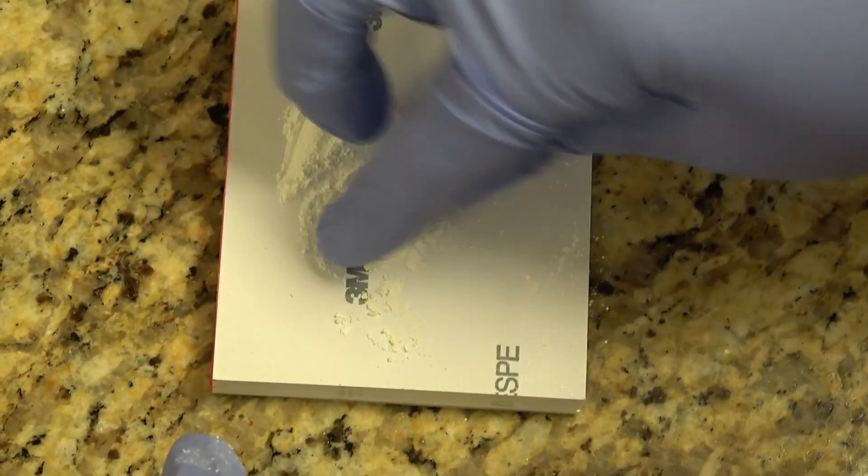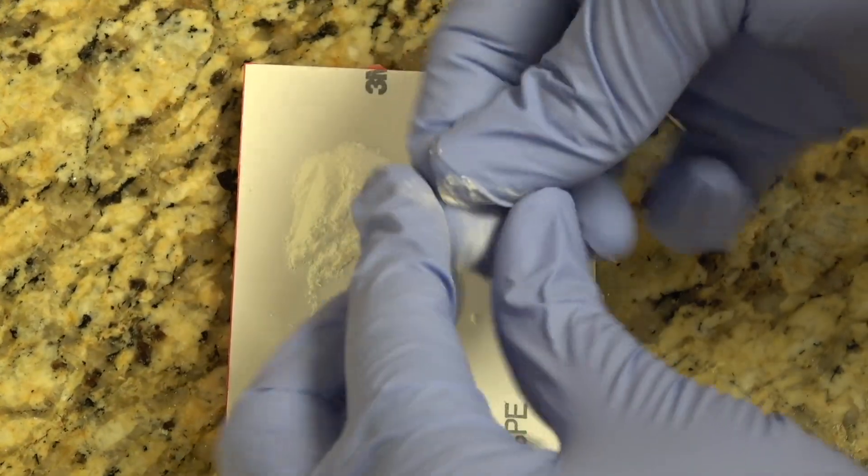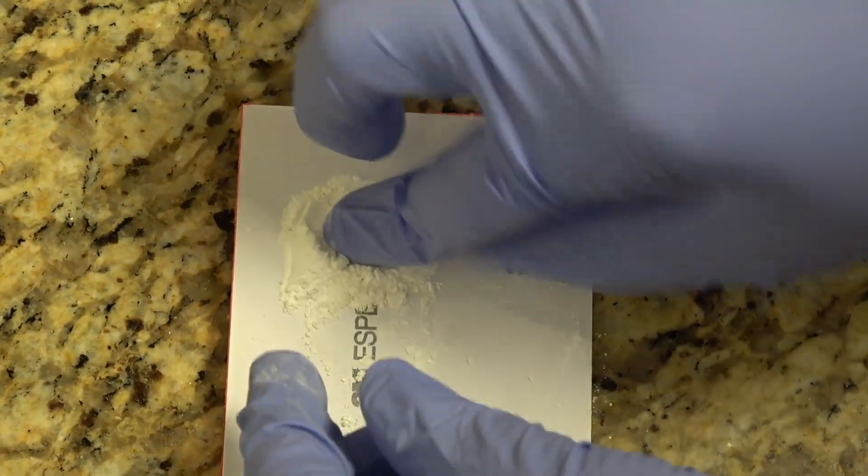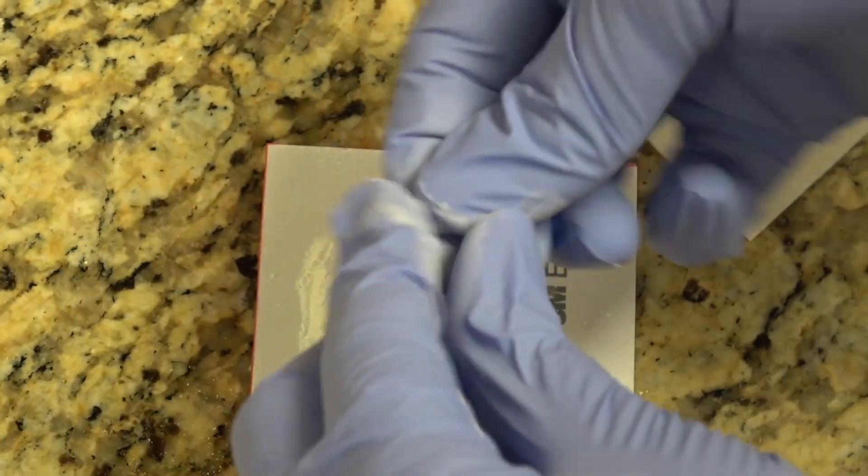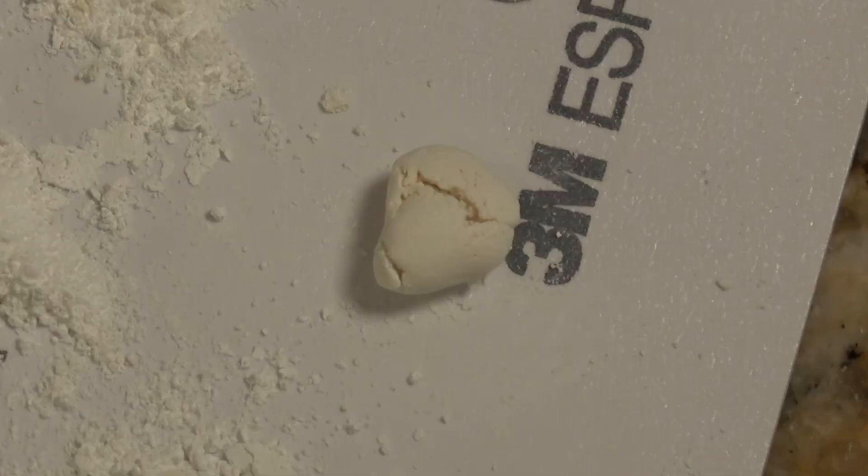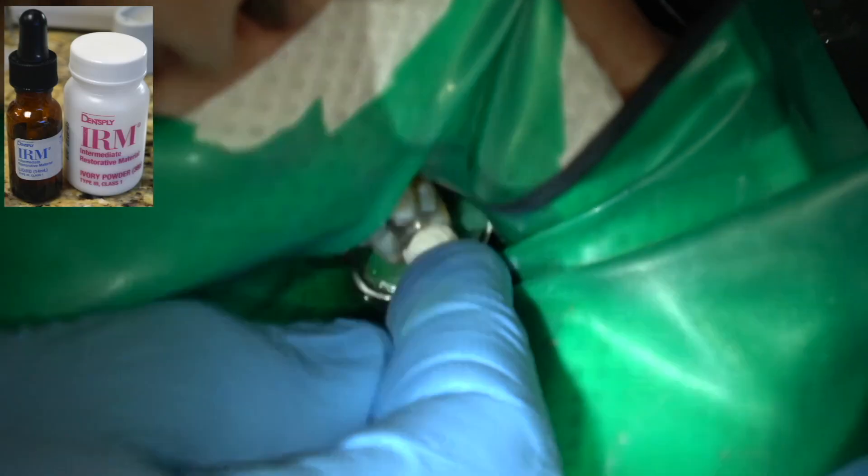If it's moist and gooey, it doesn't work as well. You just press that into the hole.